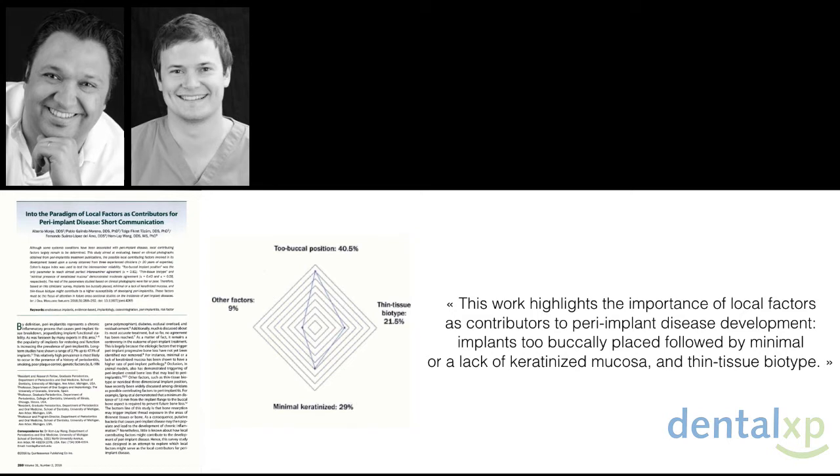And if you look at the numbers, I think it's 1.3 or 1.4 implants per case, so single implant is really the most common procedure that you will have to face, whether you're in an advanced practice or not. So, to succeed, you had better learn how to do it right. And implant 3D positioning is crucial if you want to end with a long-term predictable result.